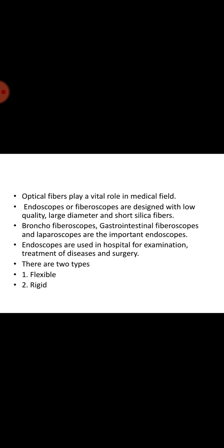Because modern endoscopy has relatively few risks, delivers detailed images, and is quick to carry out, it has proven incredibly useful in many areas of medicine. Today, tens of millions of endoscopies are carried out each year. And optical fibers play a vital role in the medical field.